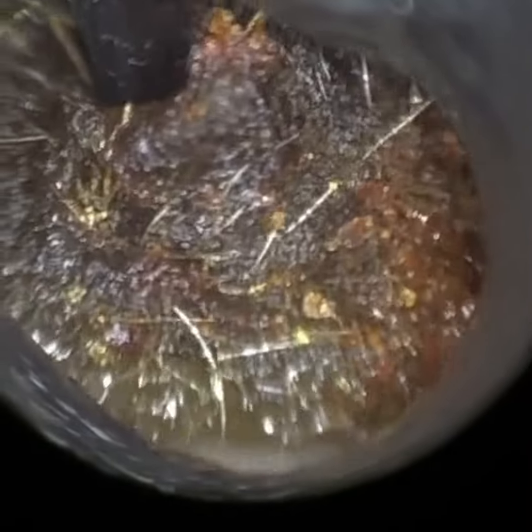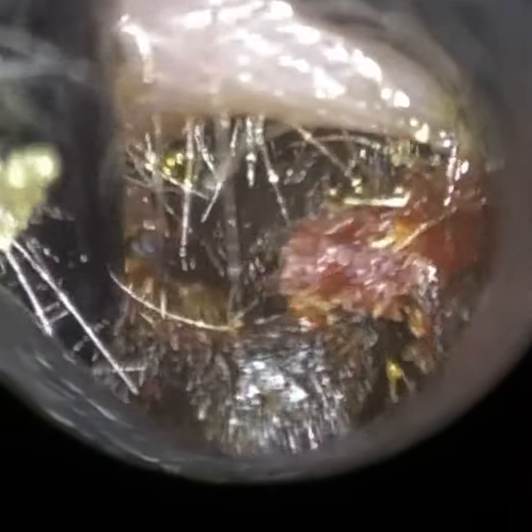This is the patient's left ear. We've still got the right ear to do — the right ear was more complex so it took a bit longer, so do stay tuned. I'm slowly bringing this wax plug forward. Some of the wax did come out, but the ear hook also just dissected through the wax — it cut through like a hot knife through butter. I'm going back in further, slowly bringing this forward. Each motion brings the wax plug forward. I think I've got the hook right behind now, trying to pull the plug out in one go, which I think I did manage in the end.